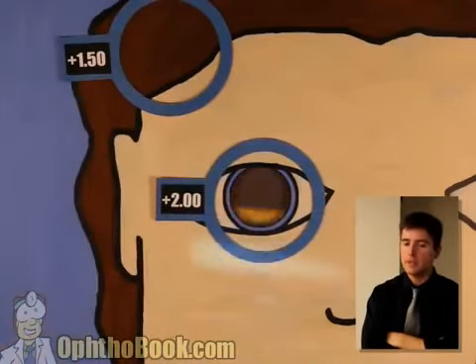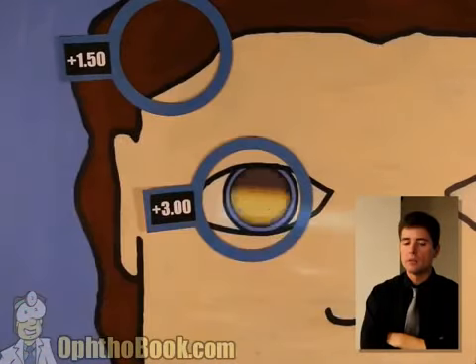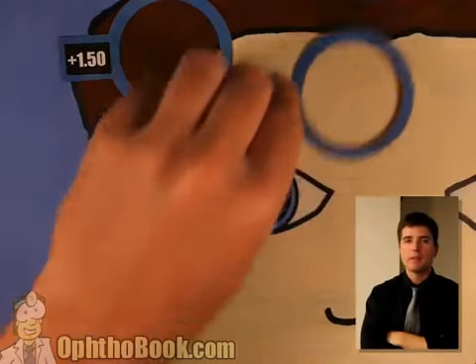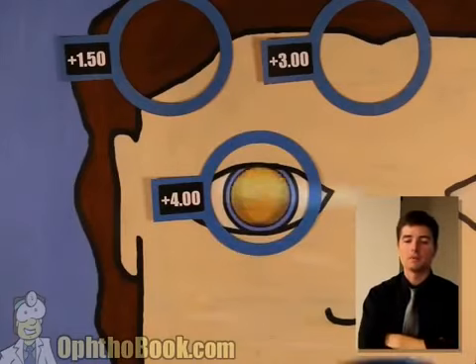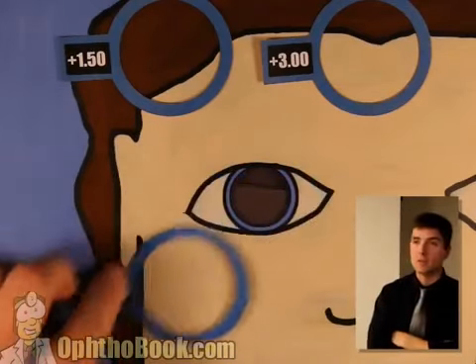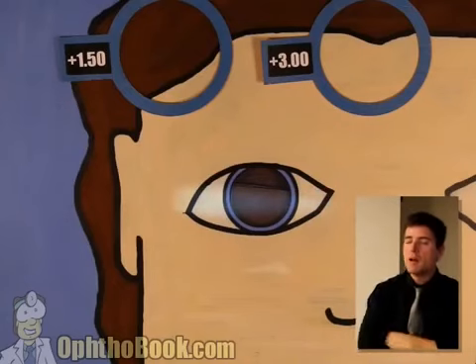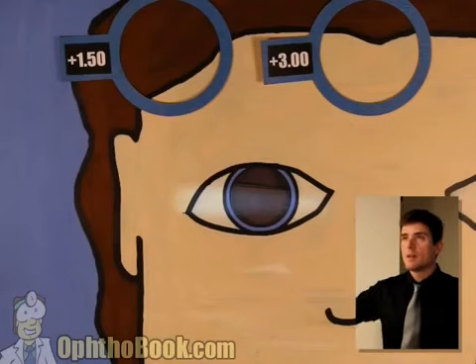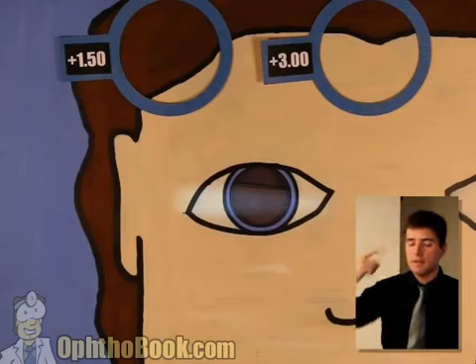Let's try +2. No, not there yet. +3. I think we got it. This is the prescription. Now if we do this in our head, let's try 4. I'm getting greedy. Sorry. No, too far. I'm glad I set that first lens aside, otherwise I would have lost it and forgotten. So what's our prescription? It's a +150 at 180. In our head, we do the subtraction, and it comes out to being a plano +150 at 180.